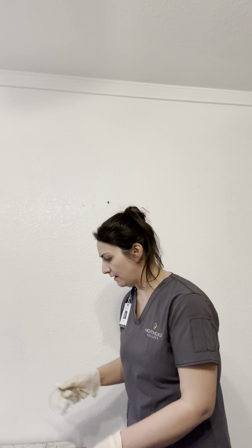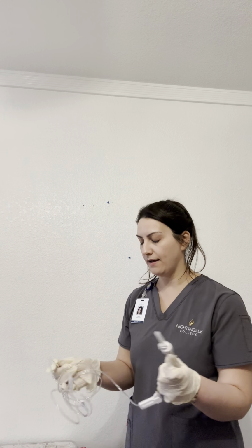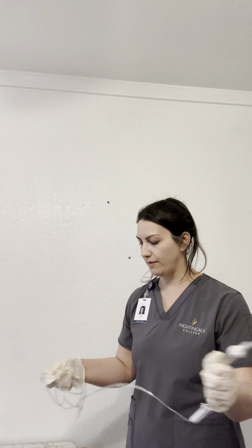So first, we're going to start with our primary tubing here. We're going to take this spike cover off, and we're also going to take this portion off too.